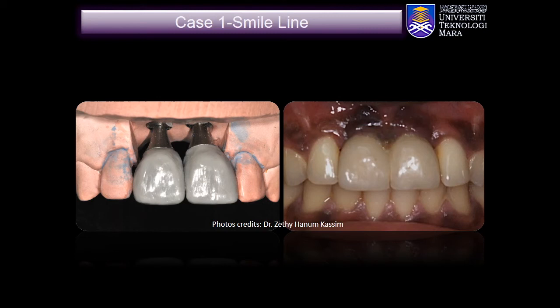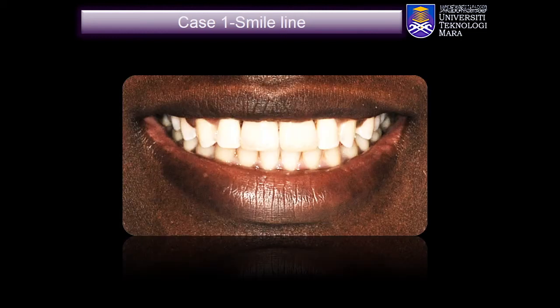The unsupported loss of interdental papilla in this case has been overcome using prosthodontic camouflage of creating a long contact point between 1-1 and 2-1. Considering that the patient has a low smile line, the final aesthetic outcome is acceptable and the patient is satisfied.